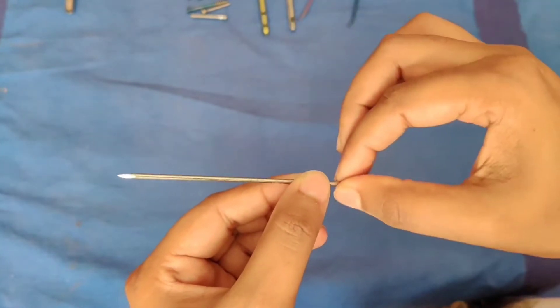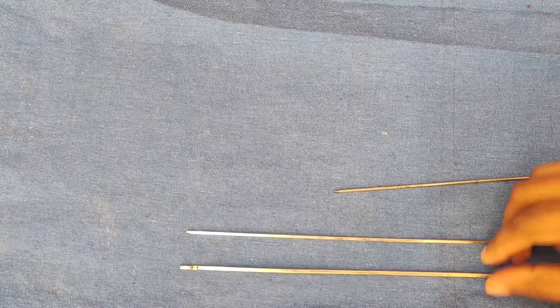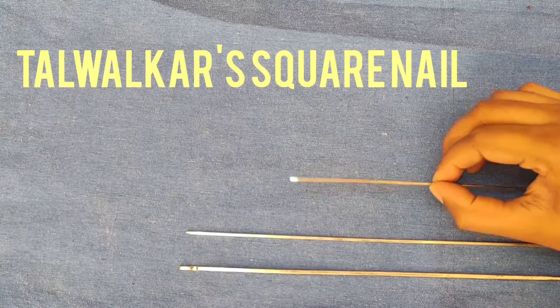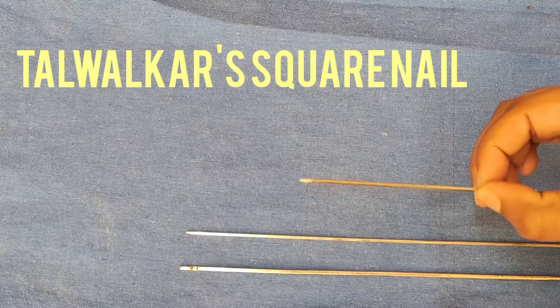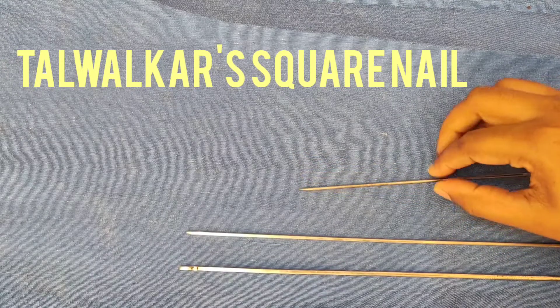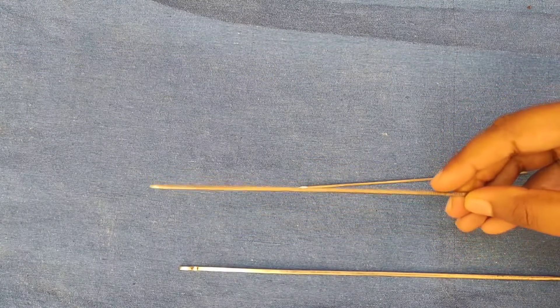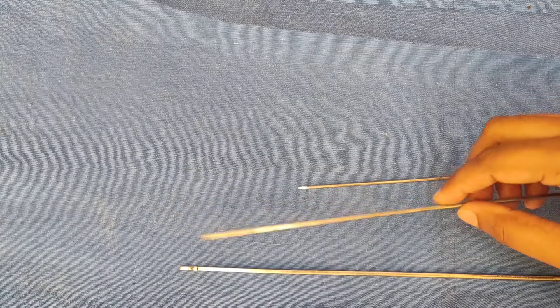Next we will discuss the square nail or Talwalkar square nail. It is a centro-medullary nail and one end of the nail is threaded for insertion and extraction of the nail.